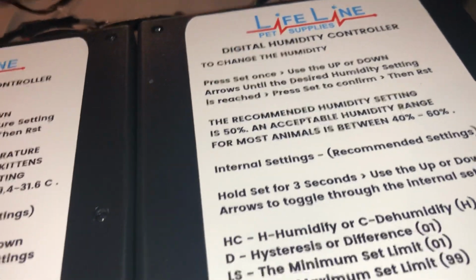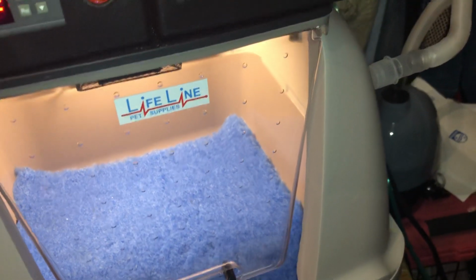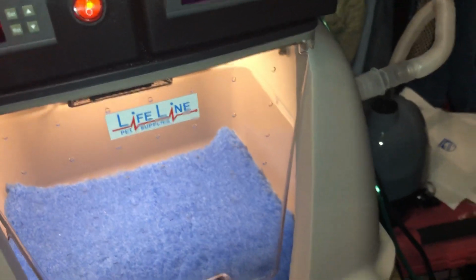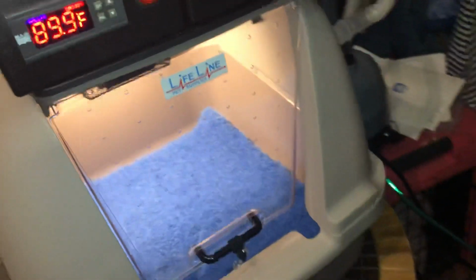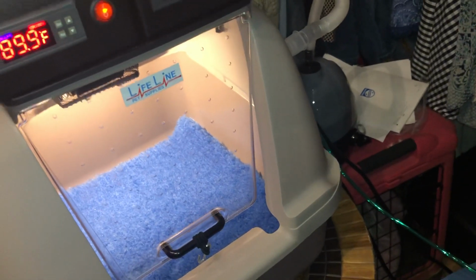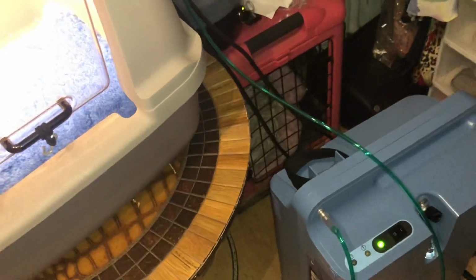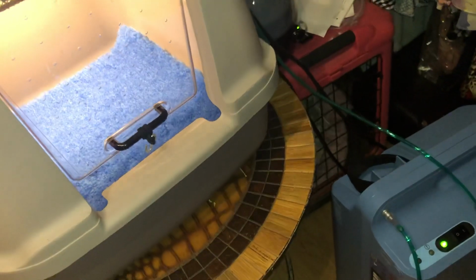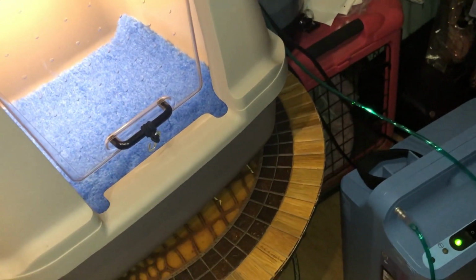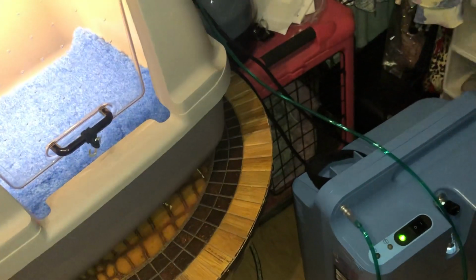So, anyhow, I highly recommend this if you have puppies that you're tube feeding that aren't sucking. Or if you're afraid that the mother's going to roll on them and you don't want her to crush them. This is another good thing to do. But it's a bad thing to do if the temperature isn't right and you mess up in that aspect. Because temperature being wrong, you can kill the puppy. Especially when you're talking about little teeny weeny teacup puppies. Regular sized puppies, that's not what I'm talking about. I'm talking about those ones that are born 2 ounces, 2.5 ounces, that aren't sucking.